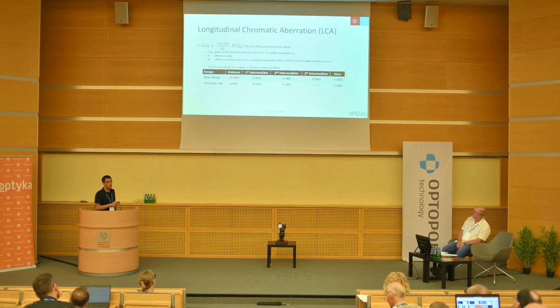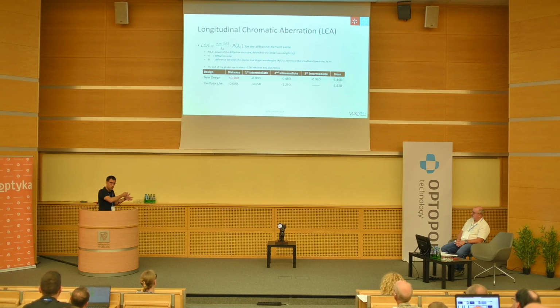Normally diffractive lenses produce negative inverse chromatic aberration at positive diffractive orders. So, for instance, a bifocal lens, for distance order, will only have the chromatic aberration of the base refractive lens, but at near it will have negative chromatic aberration that kind of compensates the one from the cornea and the one from the refractive element.